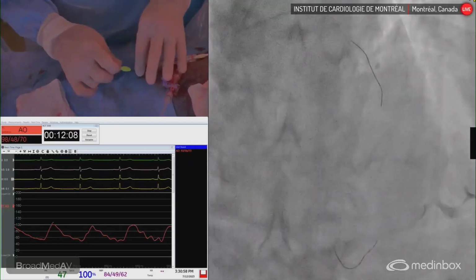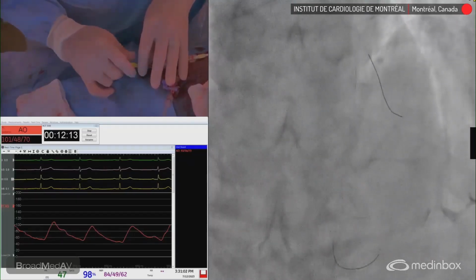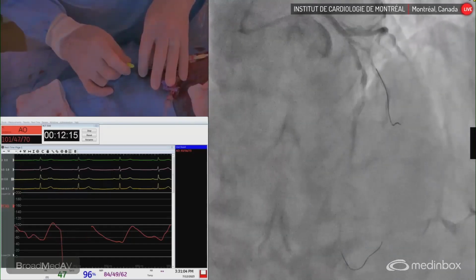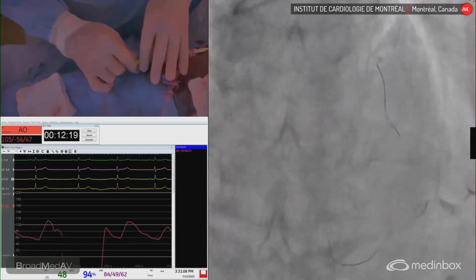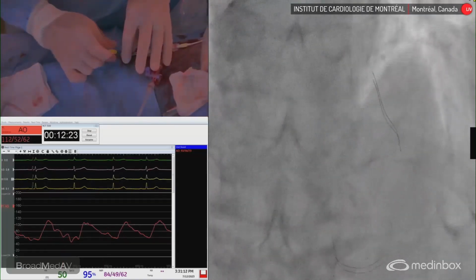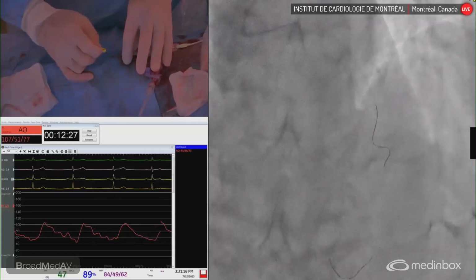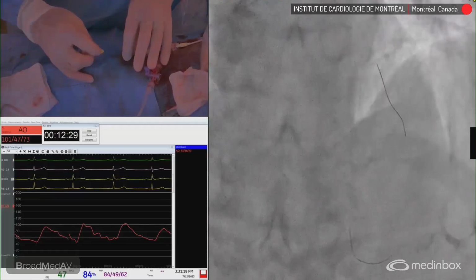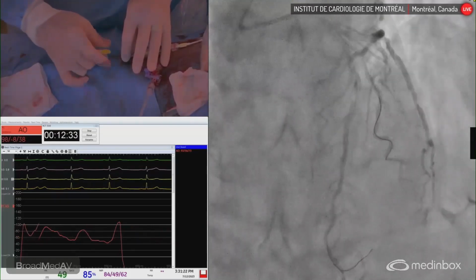Plus vite. Vous voulez un test? Oui, s'il vous plaît. On est OK pour le run. On n'en a pas besoin. C'est passé. Merci. On est dans la branche, je crois, le test. Ouais. Non, c'est bon.